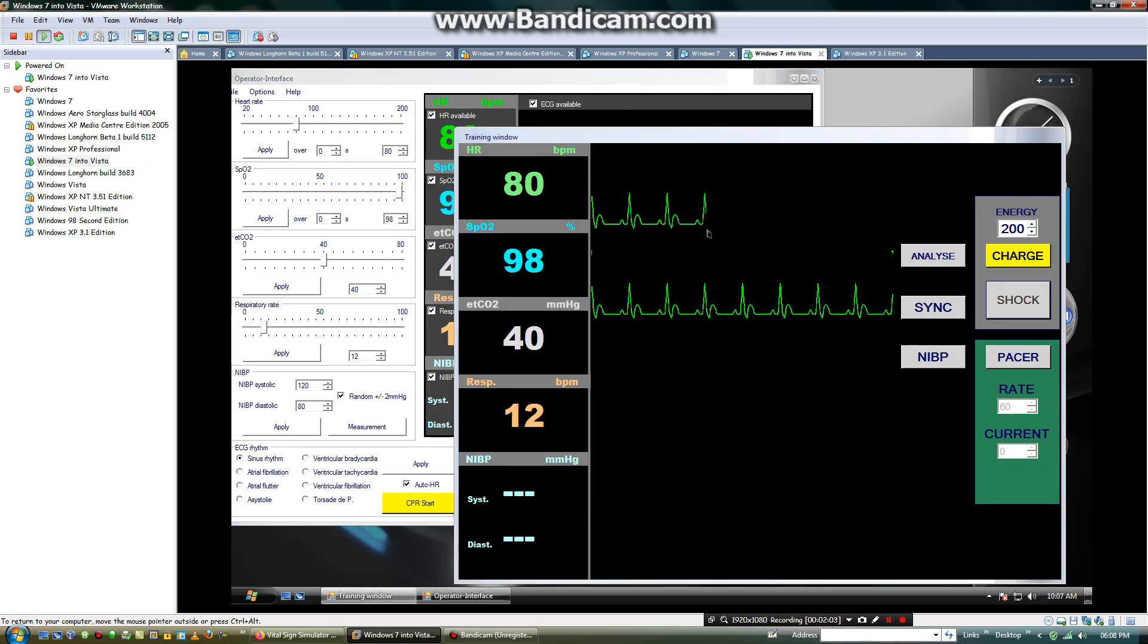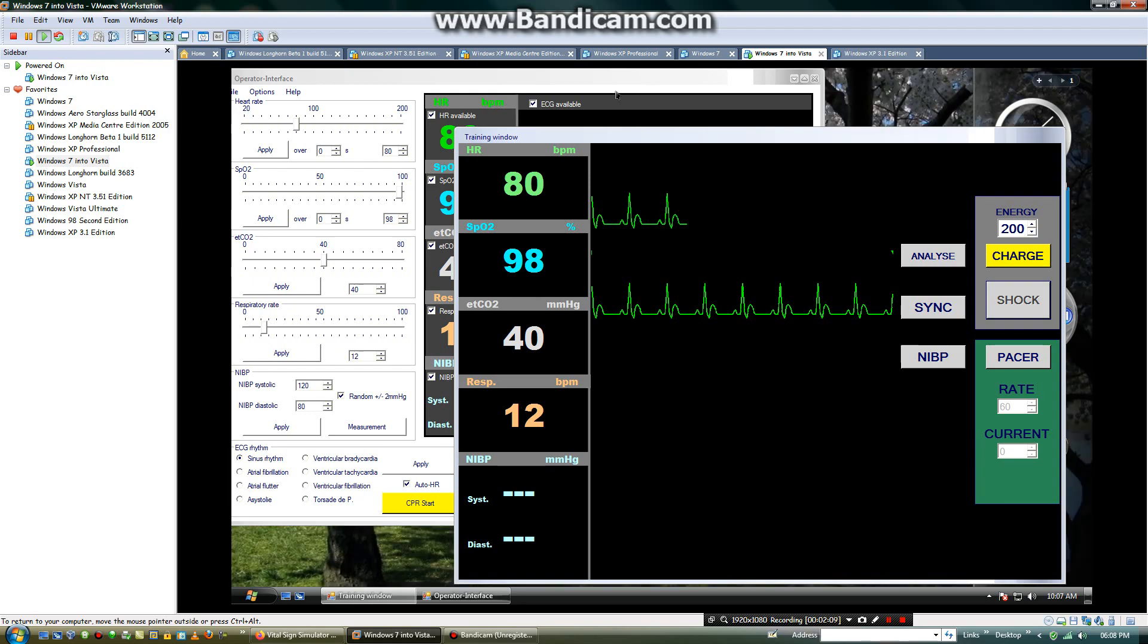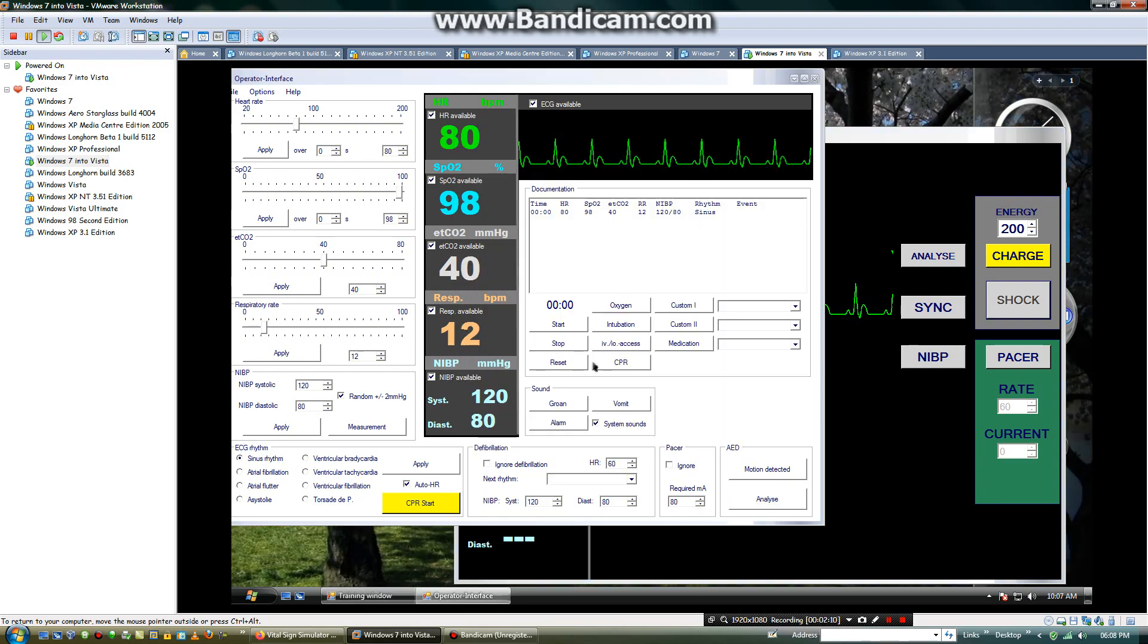You will check heart rate, SPO2, ETCO2, respiration and also an IBP. Then you will find ECG rhythms.